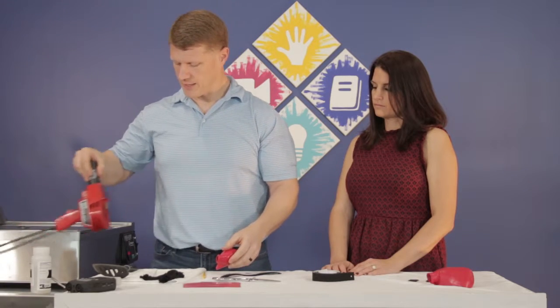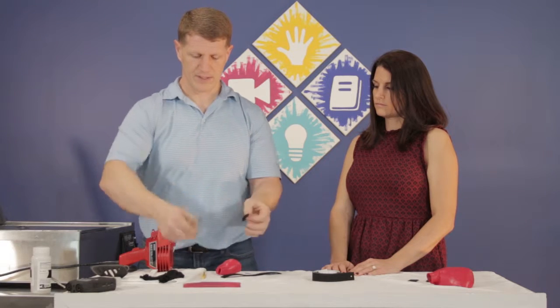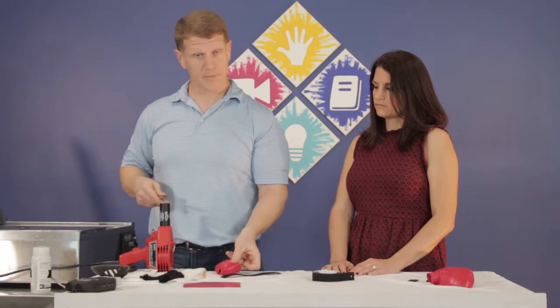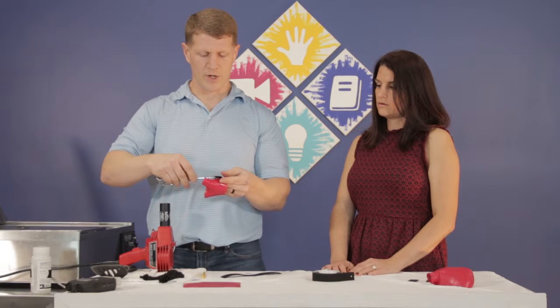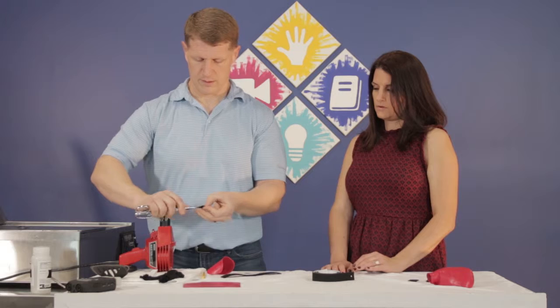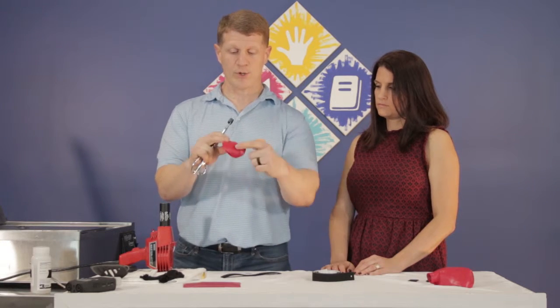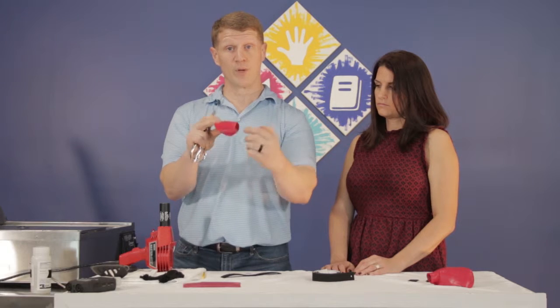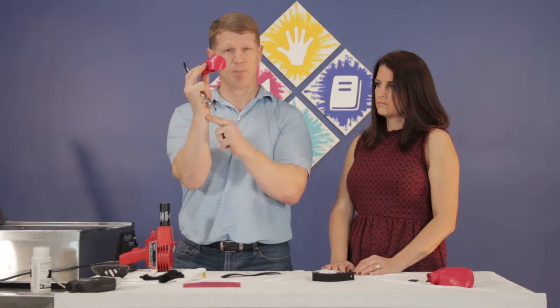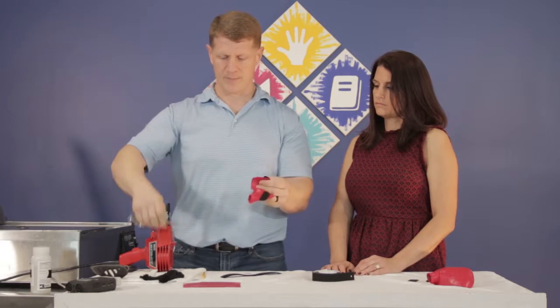Then I'm going to bring the heat gun in and we'll take the stickies off and heat up the Velcro and stick one on here. Then I'll take another one, heat that one up, and put another one so it comes down around the wrist. I don't want it coming around the hypothenar eminence — I want it below at that wrist crease level. So I'm going to angle that down just a little bit.